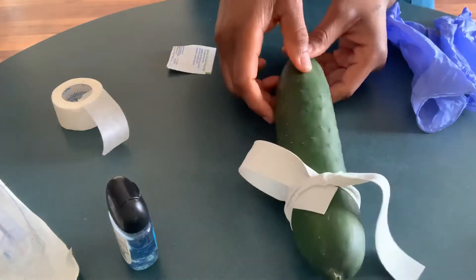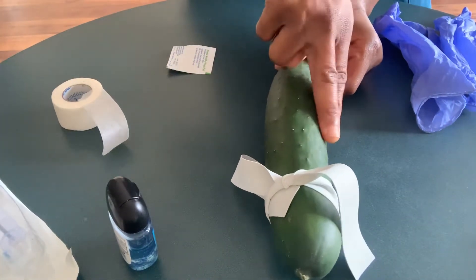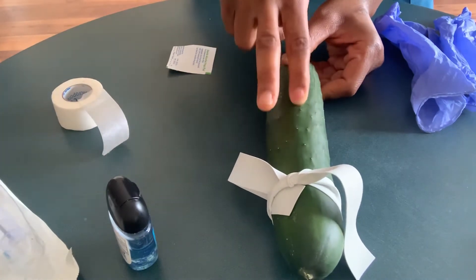So I will palpate the client to look for a good vein. I think I'm going to use this area.